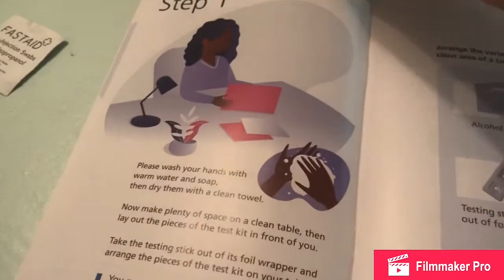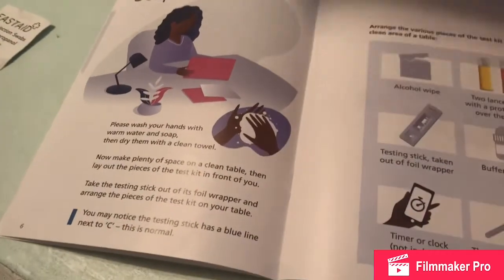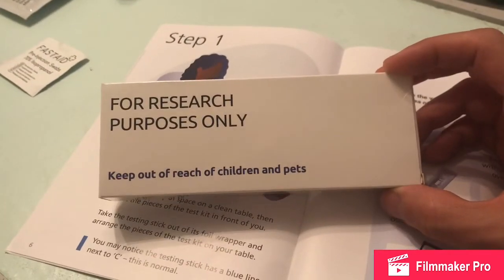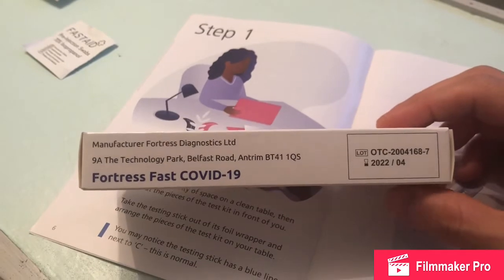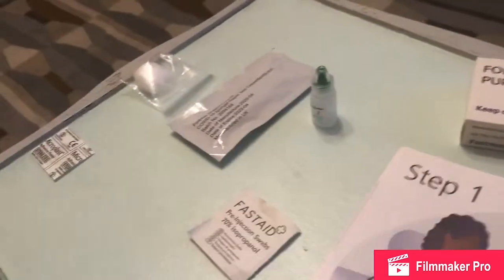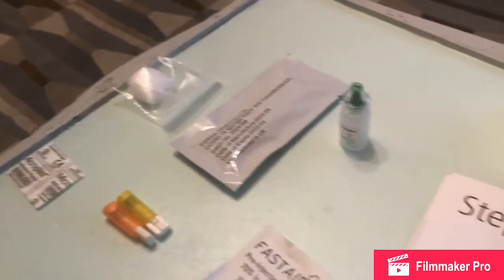Hello guys, this is just a quick video about the COVID-19 antibody test. We received this from the NHS — we were randomly selected. This is for my mum and she will be doing the test at home. This is for research purposes only, to see if she's had COVID-19 in the past or not. This is the instruction book: 'Coronavirus Antibody Test for Research Purposes Only.' These are all the kits that came with it in a plastic bag.